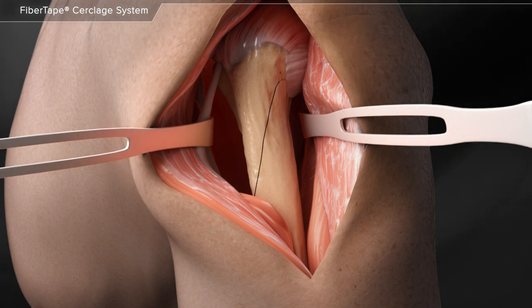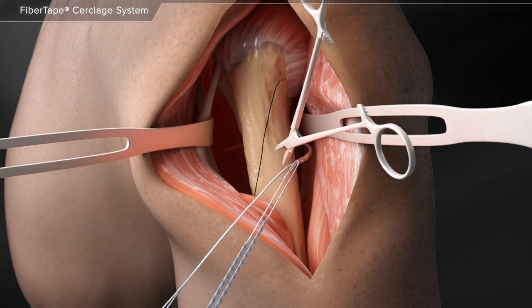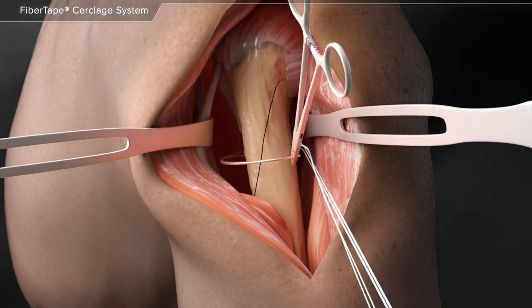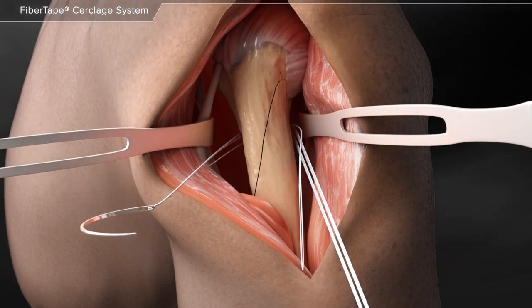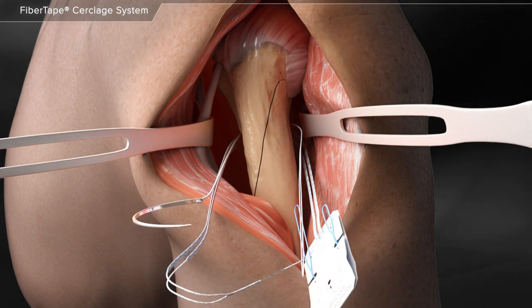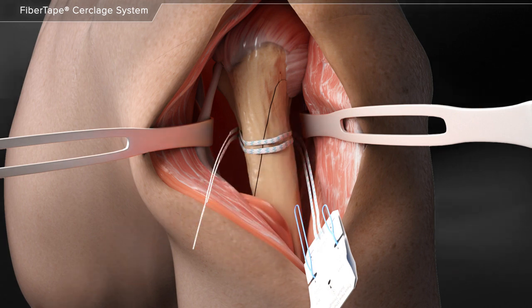site. A blunt needle can be used to pass the cerclage suture around the fracture site. The cerclage suture tail is loaded into the eyelet of the needle and then is passed around the bone. Once the needle is fully passed, you remove the FiberTape tail from the needle and load it into the suture shuttle loop that is attached to the needle to facilitate a second pass around the bone.